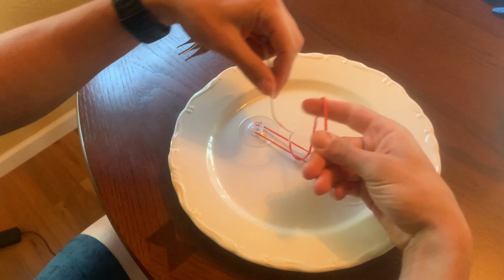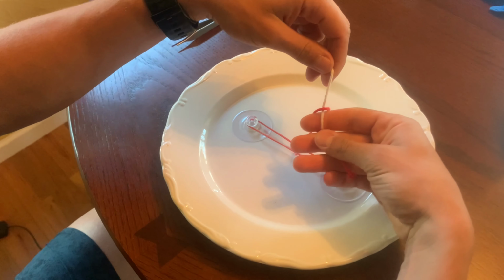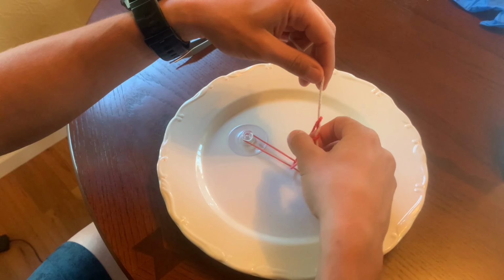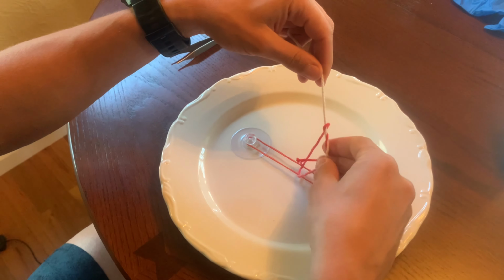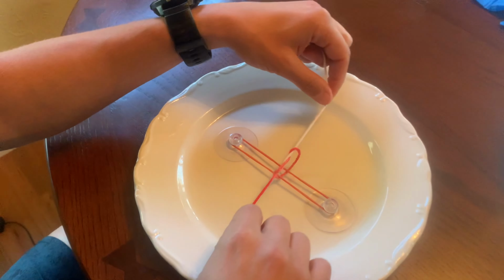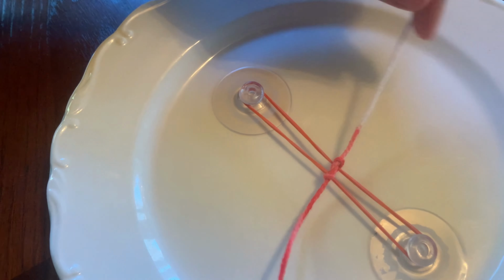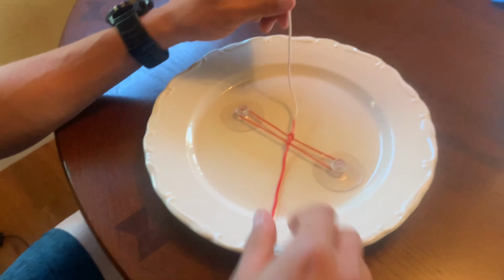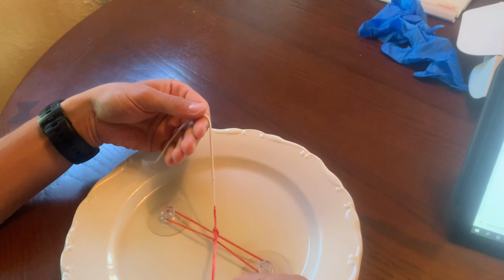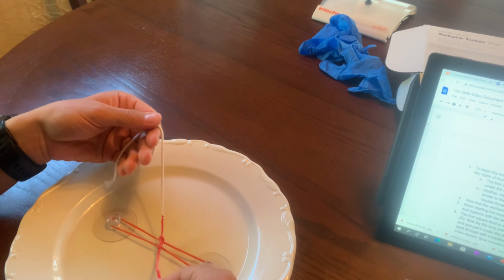So here, I'll show you. We can start, we're going to lay it over, and we're just going to start. That would be one knot, but in our case, we want to do a second loop here. So we're going to pull it through twice, and that's going to be your most secure locking knot right there. And you usually see the colors switch out. Okay. All right. Now that the anchoring knot is complete, we can begin the one-handed knot tie.